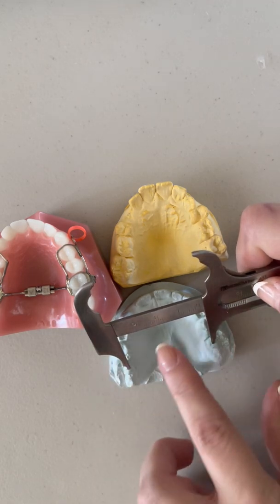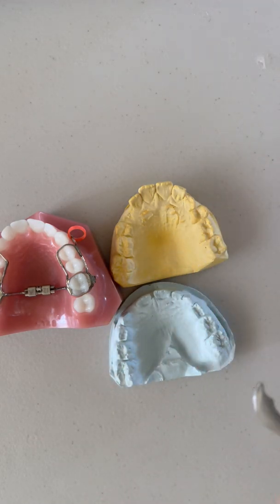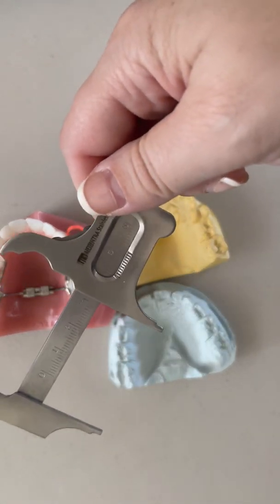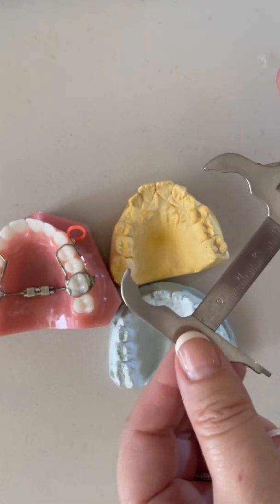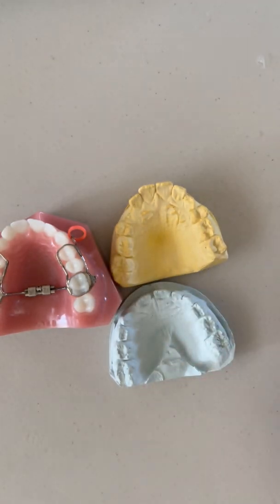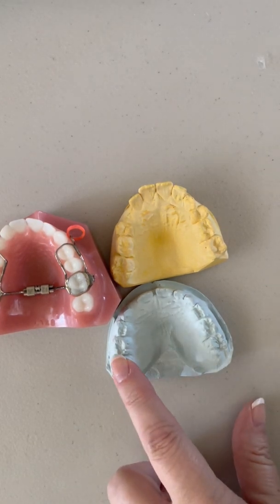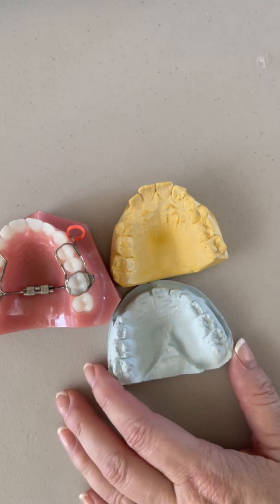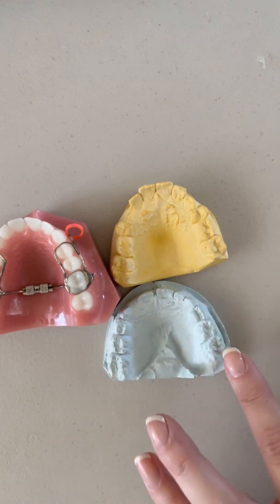This is actually my daughter and her measurement — this is after she had expansion. You can see how nice and broad her arch is. The measurement is about 43 millimeters. The magical number to me is 40 millimeters going mesial palatal cusp tip to mesial palatal cusp tip — that's for average-sized teeth, which she has. So this is after expansion — a nice broad arch form.